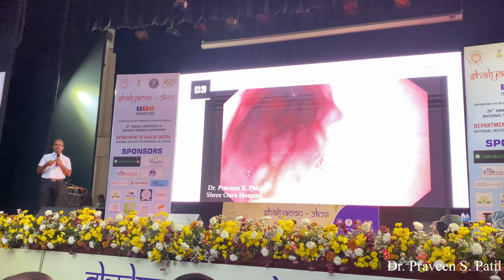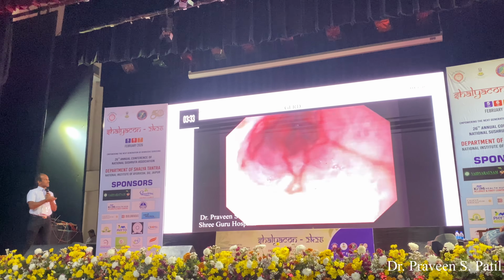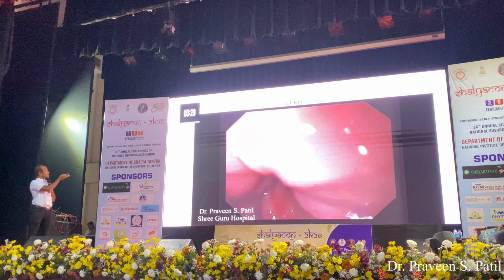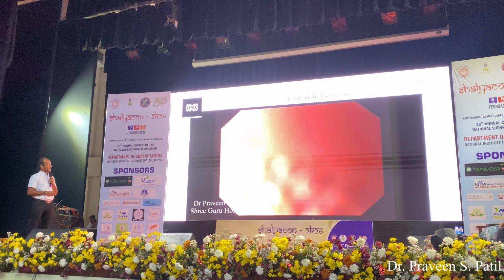That is because of pepsin and acid exposure to the squamous epithelium of the esophagus, which causes ulceration. And here we can see the mucosa of the stomach, and that itself says that it is a lax LES and causes GERD.